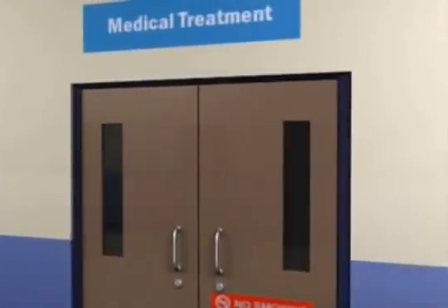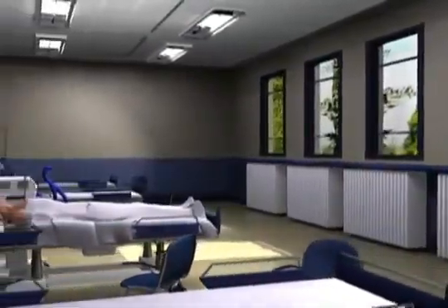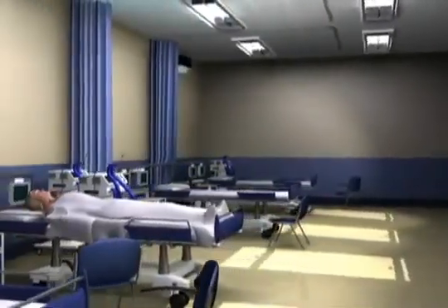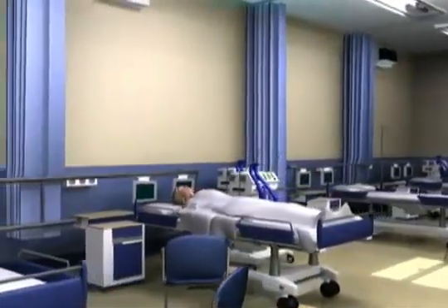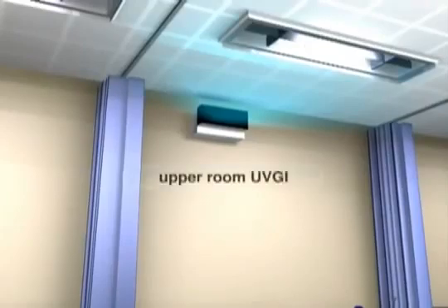Approved remediation of contaminated air spaces is ultraviolet germicidal irradiation, UVGI. The process is already well known and applied worldwide for water purification. So how does UVGI work? UVGI lamps with an armature will be installed at a safe height in the patient room, where it can perform 24 hours a day.